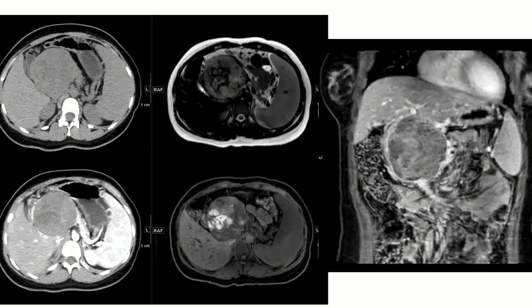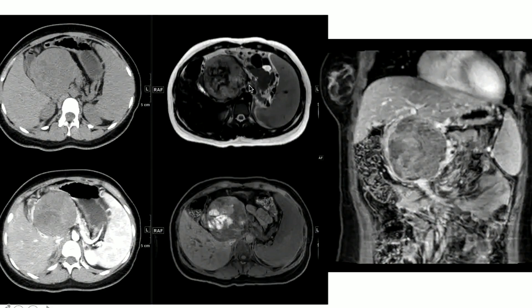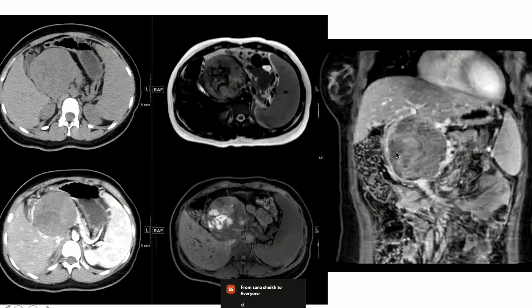The subtracted images in this case did not show any internal enhancement. You should also comment on the rest of the pancreas — the pancreatic body and tail are not atrophied, there is no ductal dilatation, and no peripancreatic lymphadenopathy. Given the size of the mass, it is compressing the duodenum, so you need to assess whether the patient has gastric outlet obstruction. Here we can see no proximal stomach dilatation, though the duodenum appears stretched.